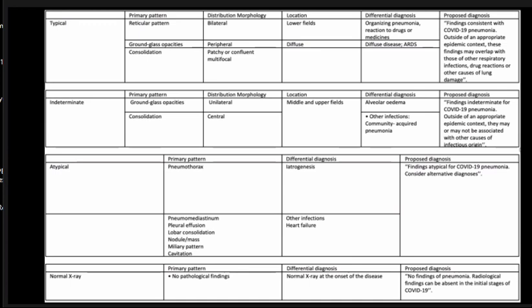Kaysa ilalagay natin pneumonia versus atelectasis. Papakamot na lang ng ulo yung mga yun eh, pagka ganun. No? So if we give them this kind of report, it shows that you have confidence, it shows that you know what you're doing, and yun naman talaga gusto nating i-build up sa inyong lahat. No? Okay, guys?